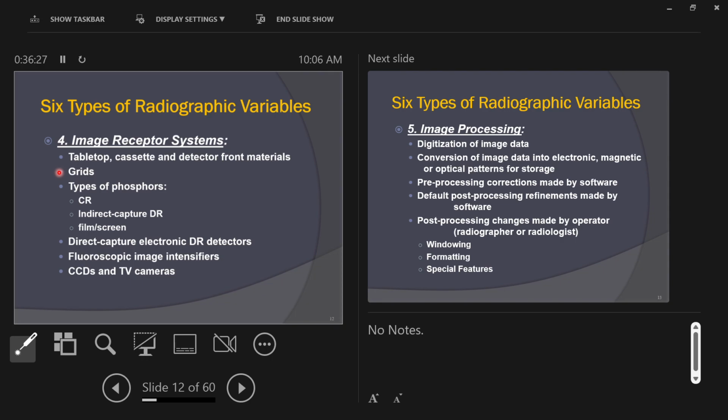All that stuff that's not the clear sound from the music that you're trying to hear is called noise, okay? In the X-ray beam, the part of the remnant beam that's not carrying the information about the patient is called noise. We want to try to maximize our signal to noise ratio, okay? We want high signal, low noise, right? High noise and low signal means we don't have a good image. So we want a lot of image signal, minimal noise. Grids are a device that help us decrease noise, increase signal when body parts are especially thick.